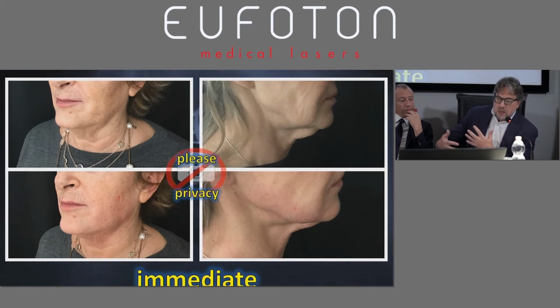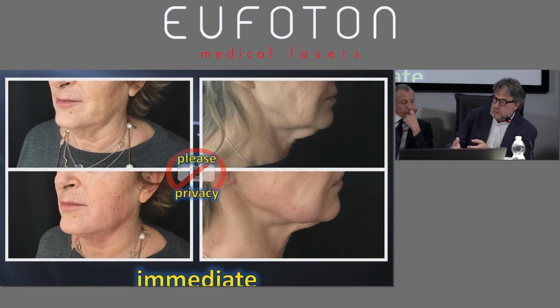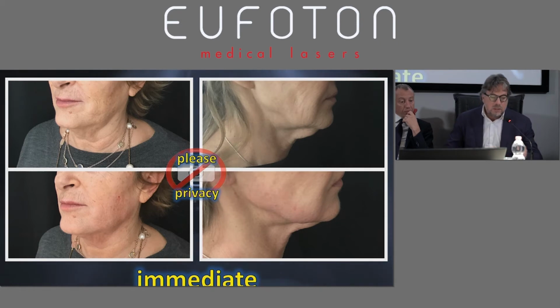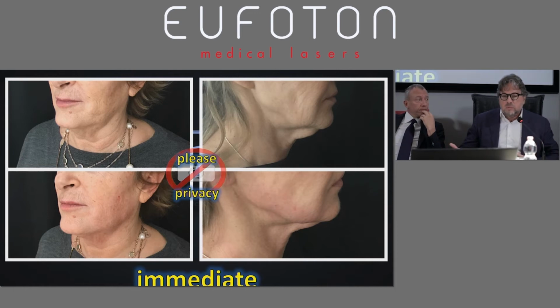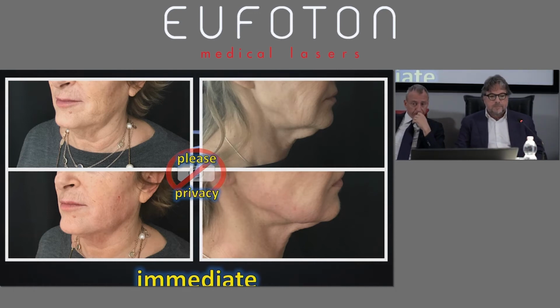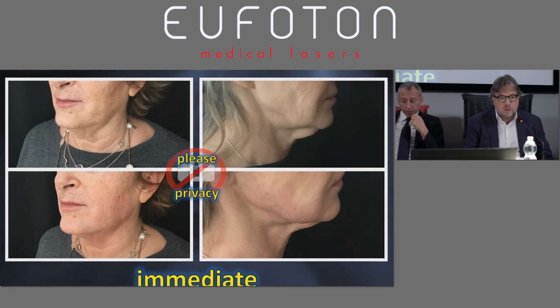I changed strategy. I work with lipolysis laser with the tumescent anesthesia, and so now I want to get rid of fat, in one shot, a one-step intervention. I do two things. I take two birds with one stone. A sort of synergic effect. So compaction is not possible if we do not eliminate fat. At the same time, one-step procedure, yes.